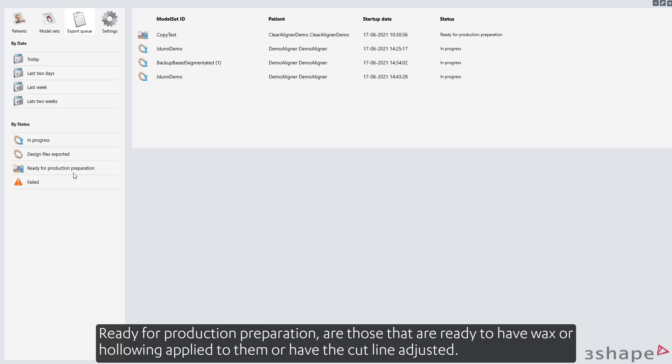Ready for production preparation are those that are ready to have wax or hollowing applied to them, or have the cut line adjusted.